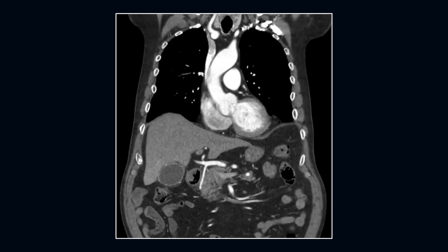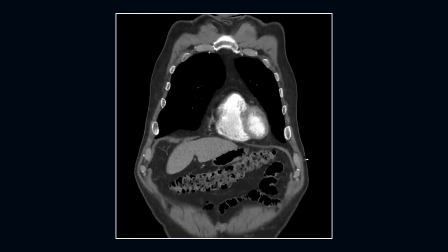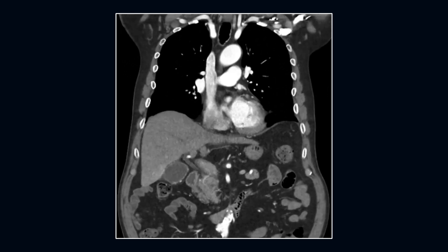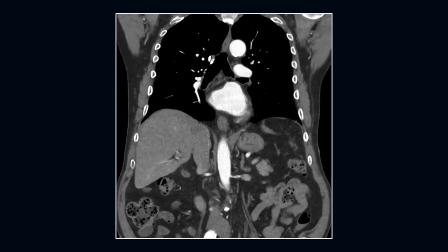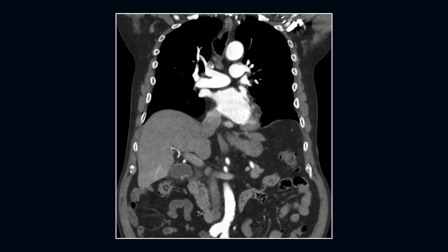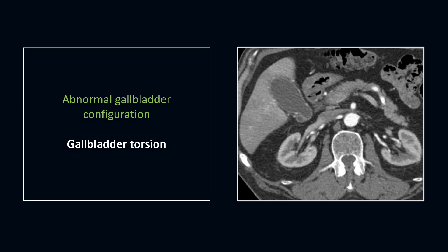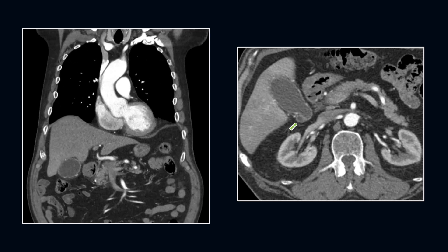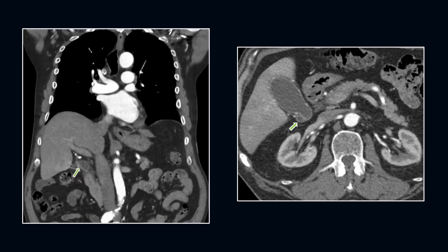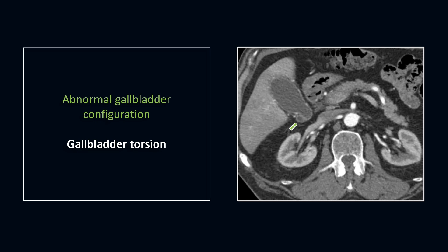Next case. Here we see that the abnormality is located in the region of the gallbladder. On the coronal images, we see that the gallbladder is distended, and there is torsion of the cystic duct of the gallbladder. We see that the gallbladder is mainly distended, there's some pericystic fluid, and you see the cystic duct torsion. These findings appear to represent gallbladder torsion.